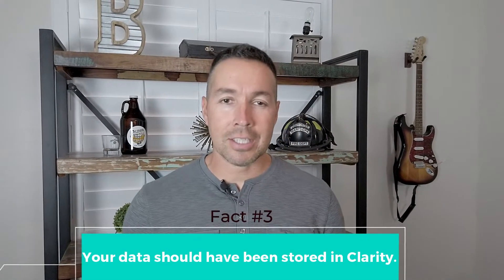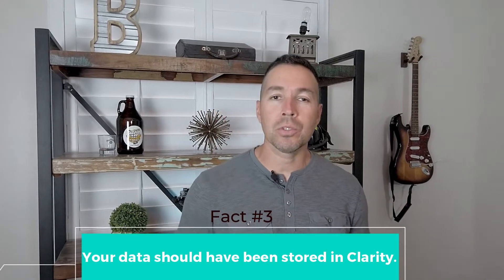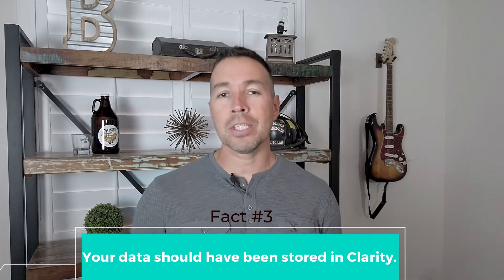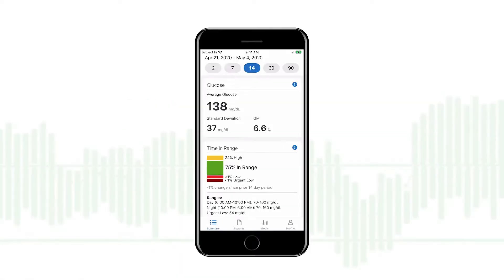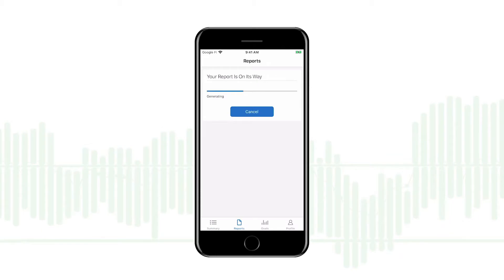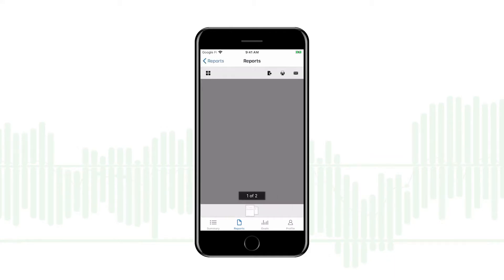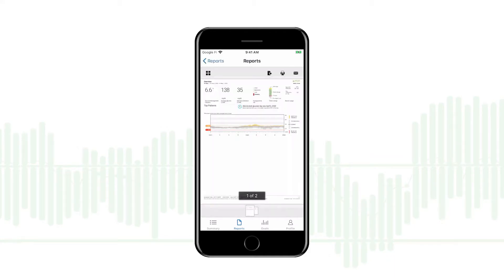Round three. Once you've installed the new version of the Dexcom G6 and Clarity apps, you will notice that the recent glucose trending information will appear to be lost. Glucose history and trends will not show up on your new device, but they can carry over uninterrupted on your Dexcom Clarity app. It's important to note that Clarity receives smartphone data automatically from the cloud and displays it in Clarity every three hours. After this information has been uploaded to the Clarity cloud, the information should never be lost, but will always have a three-hour lag.